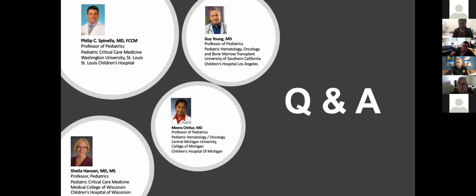So it's like when we have patients on epinephrine, right? We don't get an epinephrine level and titrate that to improve their cardiac output. We measure cardiac output. So at least from my perspective, with TEG, the R time is telling you the time to initial fibrin formation, which gives you an overall sense of their hemostatic function versus just a drug level. But I'll let that go because I didn't speak. I'm just a question asking guy.